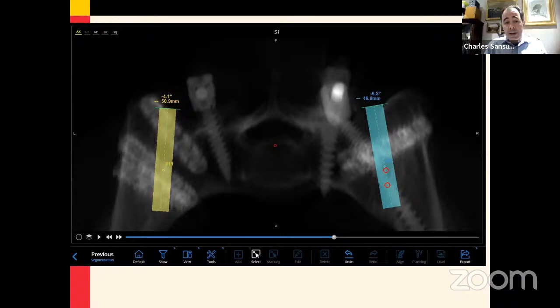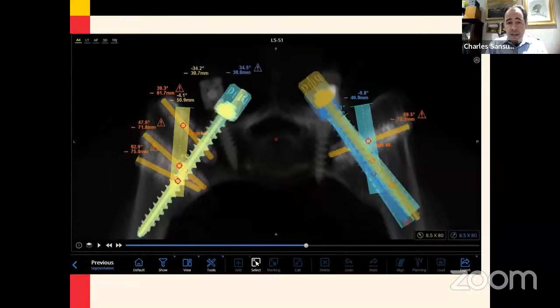Prior to being able to do that, it required removal of the ileosacral screws. We were not able to decorticate the joint without removal of some of the hardware because the hardware would be in the way. The robot was quite useful in creating the trajectories to access the screws — that would be step one: removing the ileosacral screws.